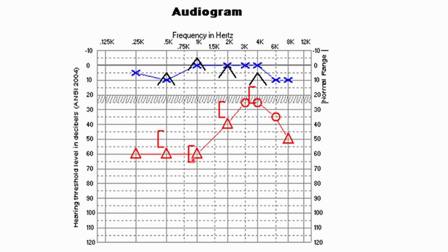So this again is uprising type, so the diagnosis may be Meniere's disease if single diagnosis, and if differential diagnosis, then any other condition can come. But two most important, if this graph is like this or downsloping, then the most likely diagnosis is not Meniere's, then it will be acoustic neuroma.